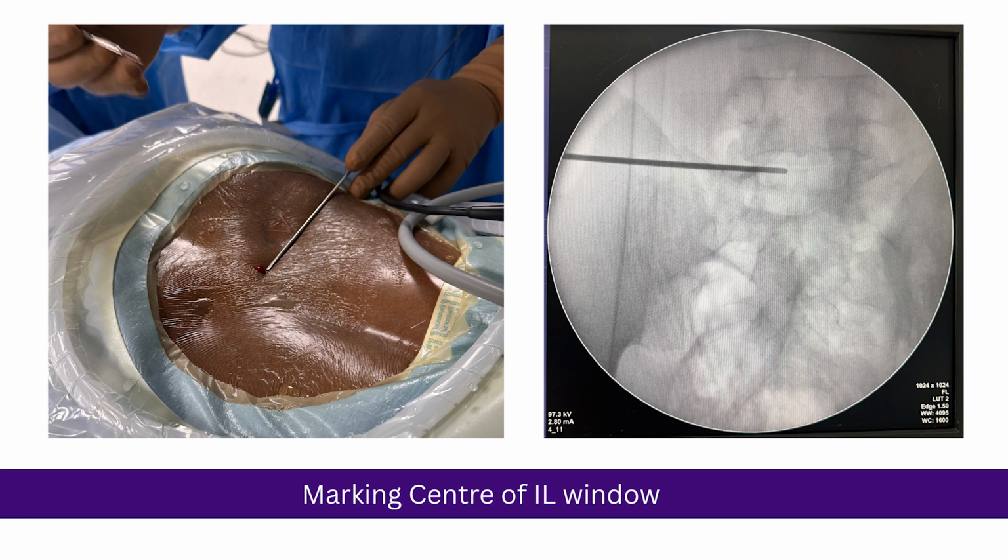Here I always take the incision in AP view. Few people prefer to take the incision in lateral view as well, but I always prefer to take the incision in the AP view.